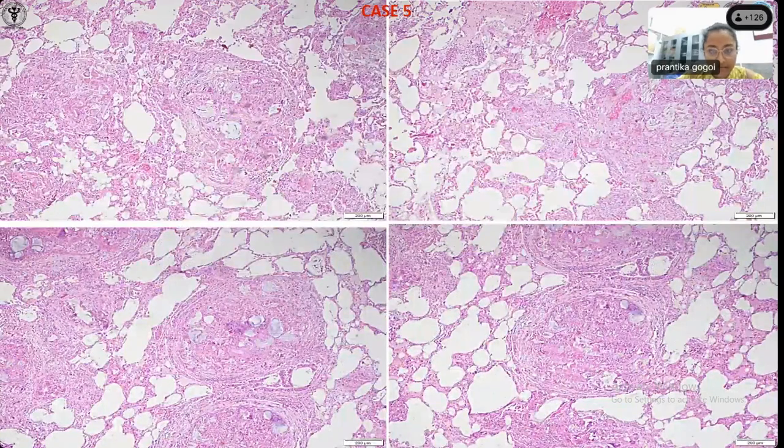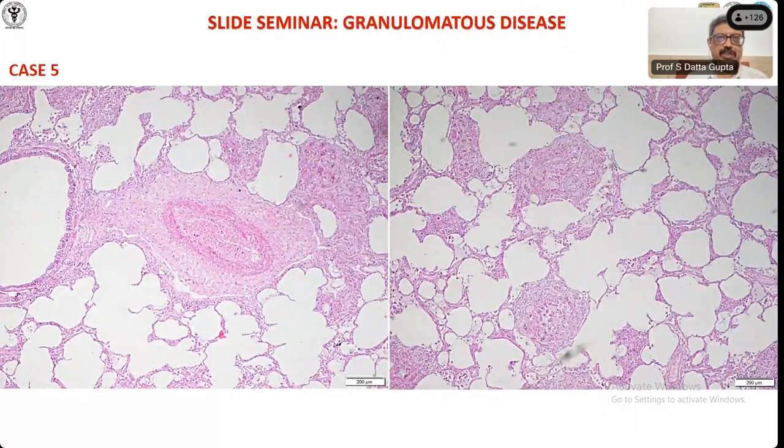Yes, Sudhir. Sir? Many people have asked, how do you differentiate interstitial granulomas from intraalveolar ones? Interstitial granulomas means granulomas present in the alveolar interstitium. See this, this is the interalveolar septum. All of you can see, there is one alveolus here, one alveolus here. If you find a granuloma here, this is called an interstitial granuloma. Intraalveolar granuloma means you see a granuloma within the alveolar lumen. Understand? Just like in hypersensitivity pneumonitis, those things you see intraalveolar granulomas. And interstitial granulomas within the alveolar interstitium, this space most commonly, because it is the space where you have lymphovascular structures, sarcoidosis will be the main differential. Understood?